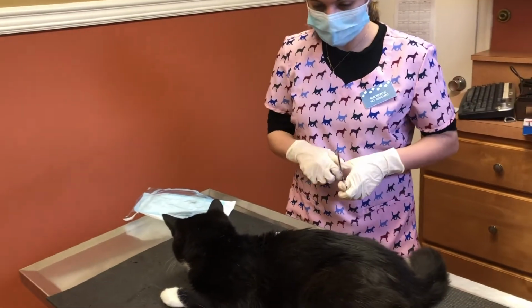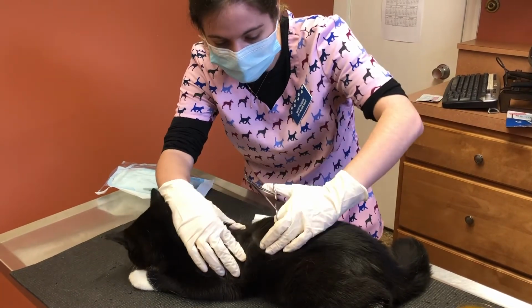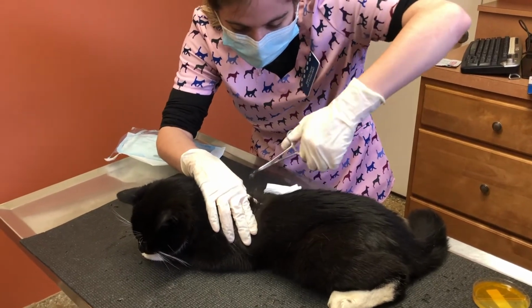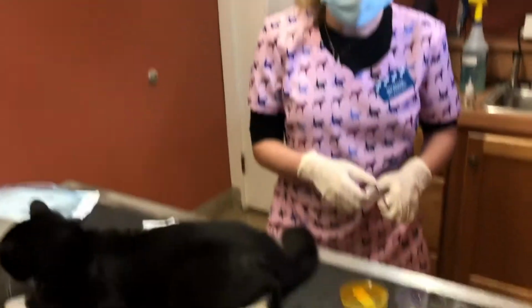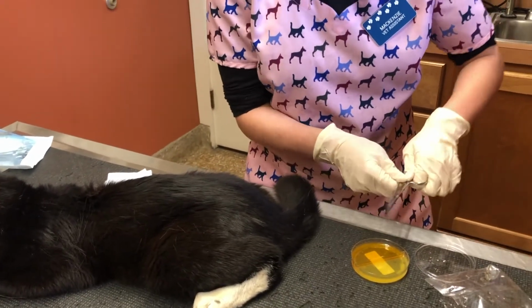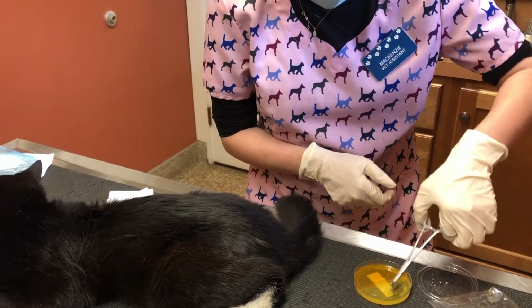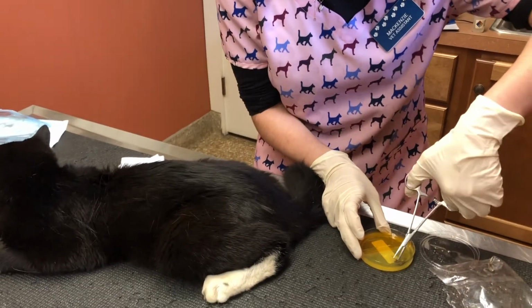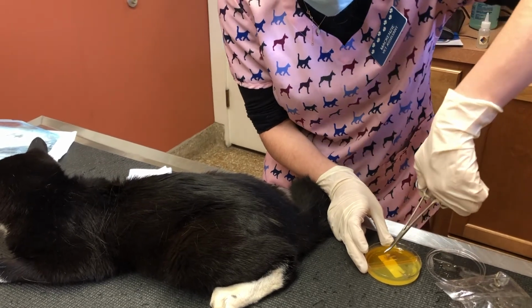So I have my sterile hemostats, and I'm going to pluck hairs from the periphery of my lesion. I don't know if you can see it right there. Okay, so I have my hairs. This medium has dual sides, so I'm going to be inoculating it using both sides. So I will put my hair sample in, and I'm going to push it down a little bit into the medium. And I'll take some of them and put it into this side as well. Do the same thing, push it into my medium.